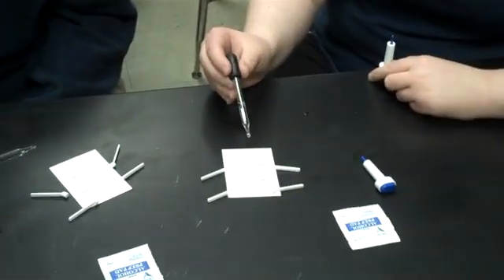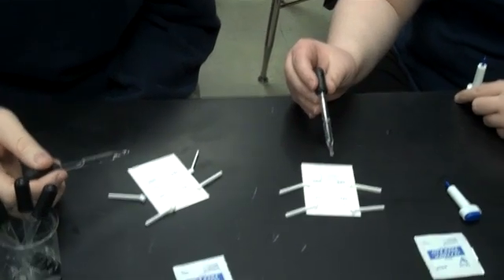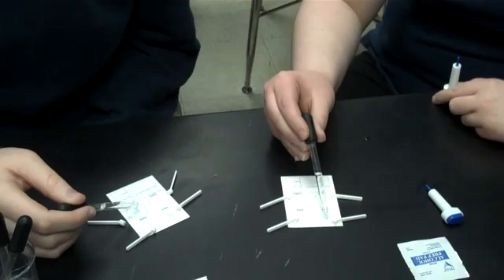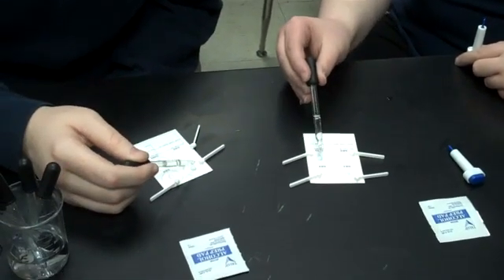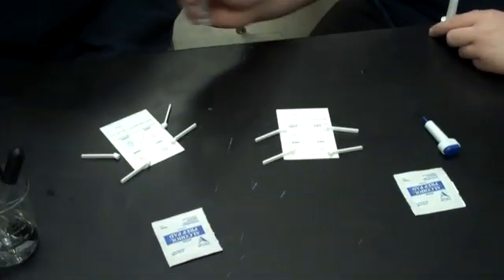Stephanie and Amber are going to demonstrate how to take their blood tests. First of all, they're going to put a drop of water on the Eldon card. This is going to activate the serum on there.